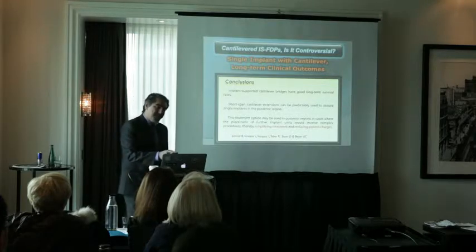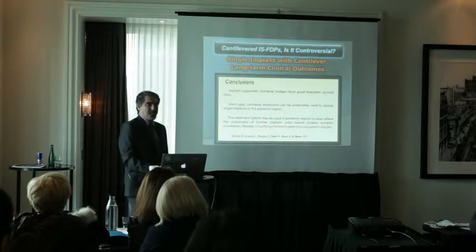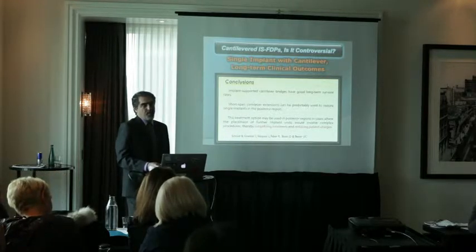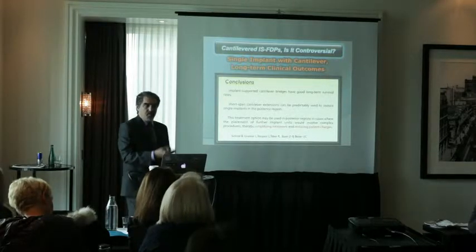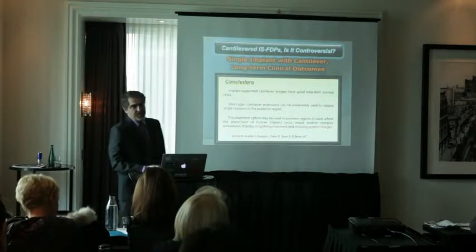That was actually one of the very interesting findings, that there was no difference. There was absolutely no difference between the mesial and distal. That was one of the objectives of the study. They checked both mesial and distal, no difference between the two. You would say that most probably the distal ones are going to have more mechanical problems, but no, they didn't show such a thing. Maybe the sample size was not big enough.